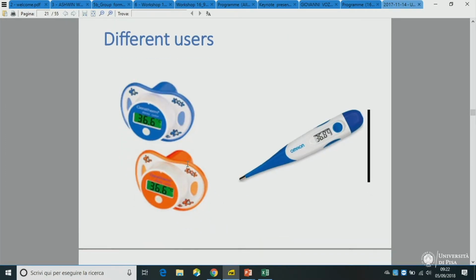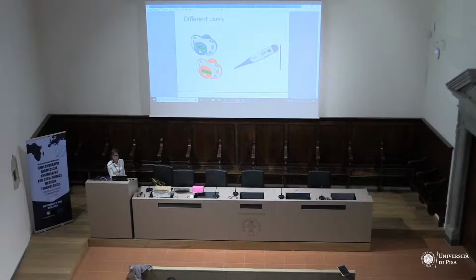And this is my favorite slide ever. This is my core slide of the day. Do you agree with me? This is the same technology. There's nothing different. But have you ever tried to take a temperature to a screaming baby? I have. It's so difficult. So thank you, biomedical engineer who thought about putting a thermometer in a pacifier. What is the difference in the patient's life in this?